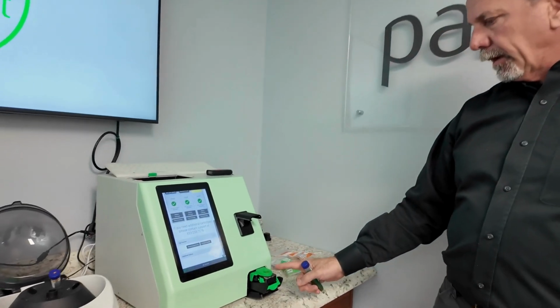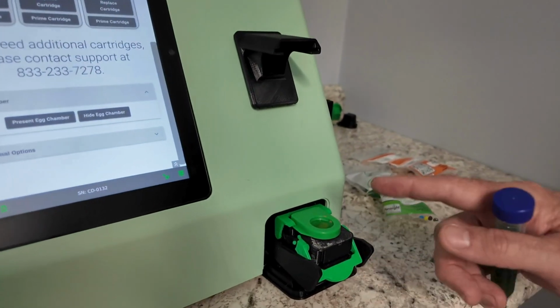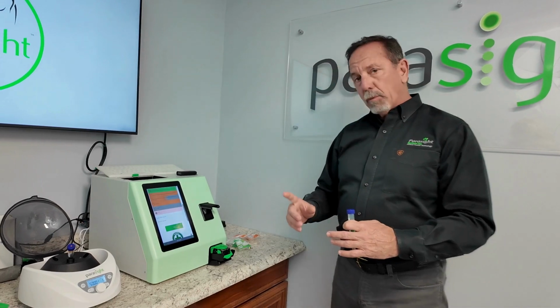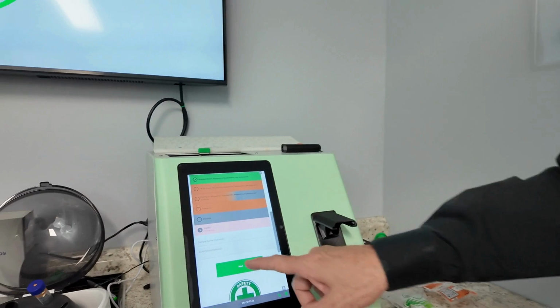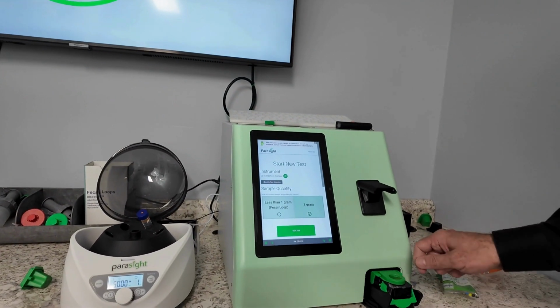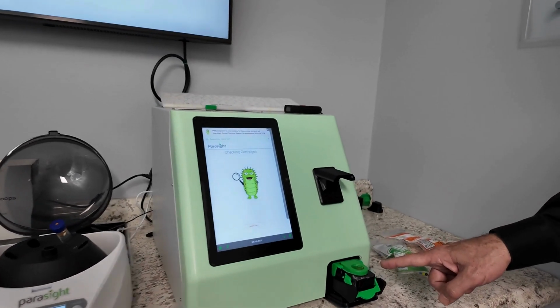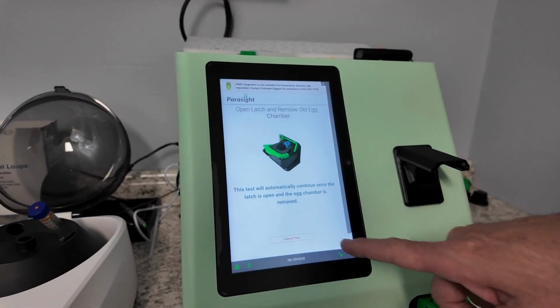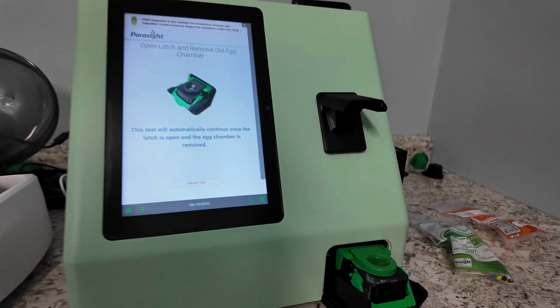You'll have the specimen chamber in the unit, and we'll go ahead and show you what it will look like clogged. What you'll experience is something like this. Here we're going to start a new test, and you'll notice that I've already poured this specimen in here. We'll start the test, and you'll notice when you go in here that it's going to try to suck the test down, and it will not be able to clear the egg chamber.